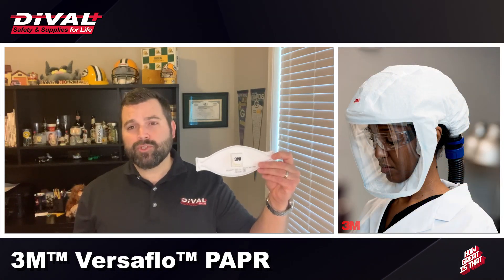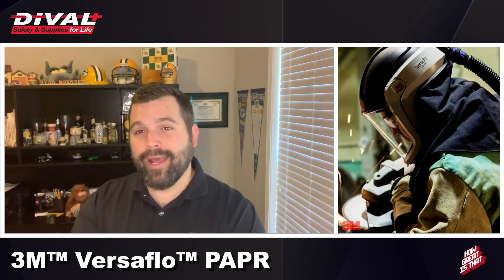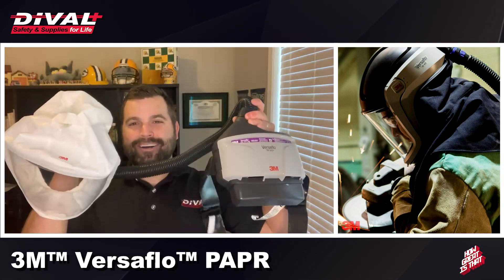One of those solutions we're going to discuss today is a powered air purifying respirator, otherwise known as a PAPR device.